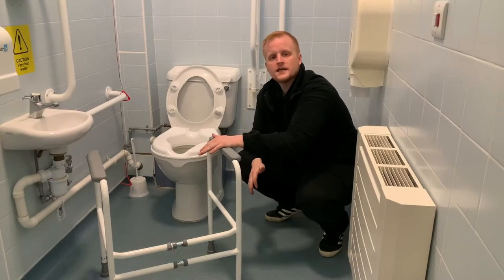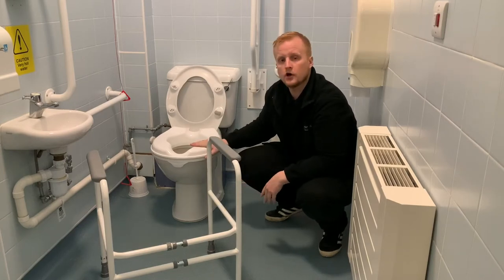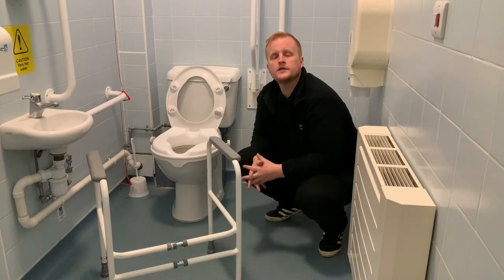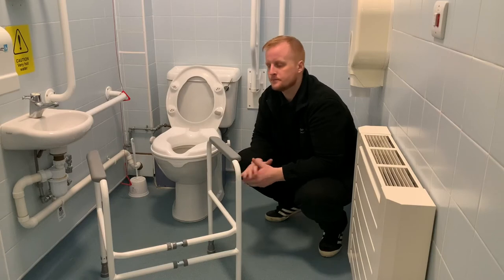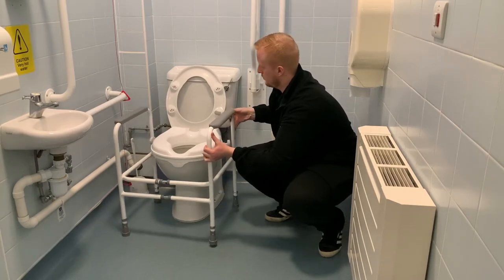What we have here is the freestanding toilet frame. We can use that with or without your toilet raiser. It's width and height adjustable, so depending on your height or your width, we'll adjust it to that individual's needs. It literally just fits around the toilet bowl itself.